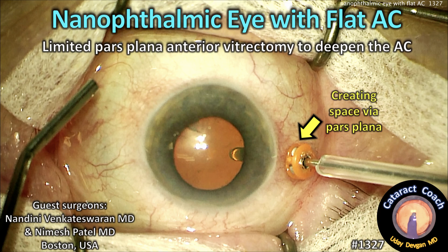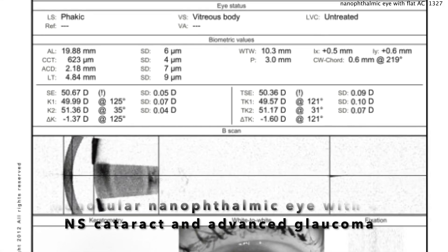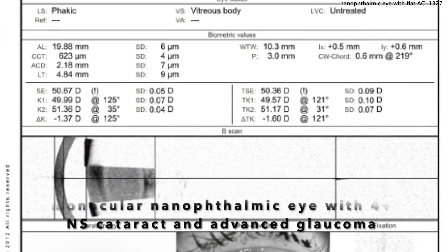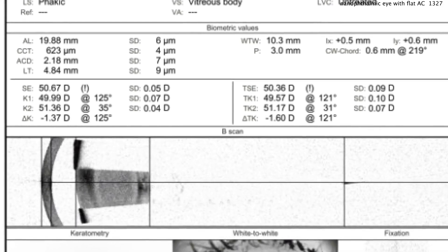CataractCoach.com. A nanophthalmic eye with a flat anterior chamber. We're doing a limited pars plana vitrectomy to help deepen the AC. Very tiny eye — less than 20mm axial length. Look at that steep cornea. AC depth is only 2 millimeters. Gonna be tough. Advanced glaucoma plus the dense cataract. How are you going to approach this case?